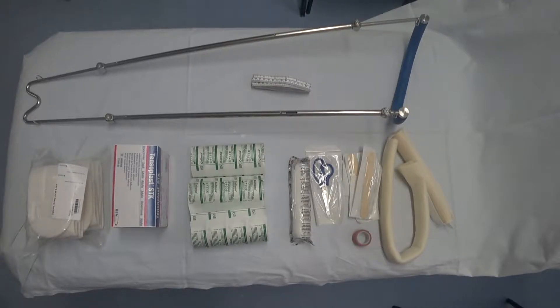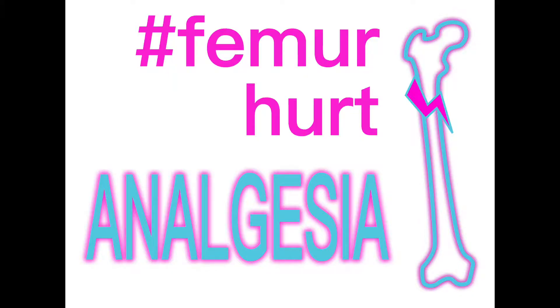To apply a Thomas splint you'll need the following: an adult or paediatric Thomas splint with an appropriate sized hoop, measuring tape, sling set, hoop pad, a couple of rolls of padding, adult or paediatric skin traction, a couple of bandages, as well as scissors, tape and a couple of tongue depressors.